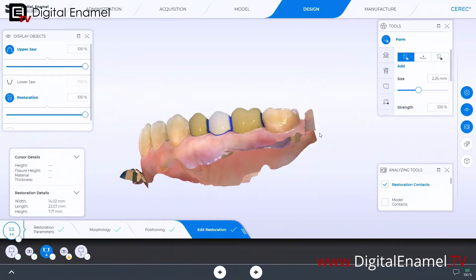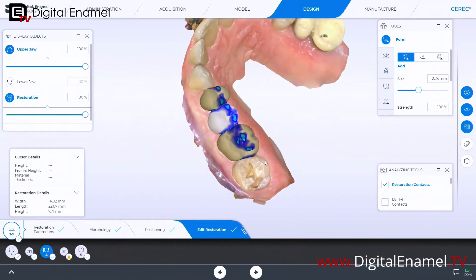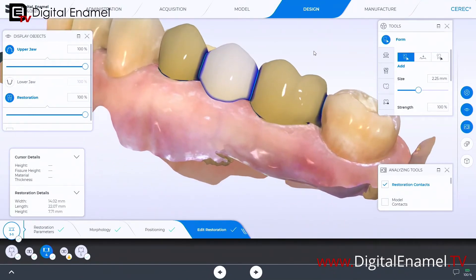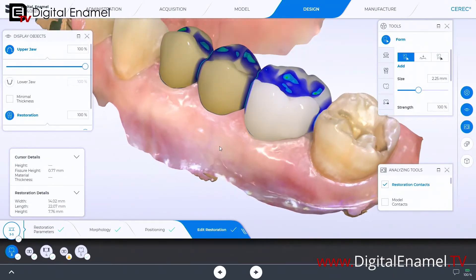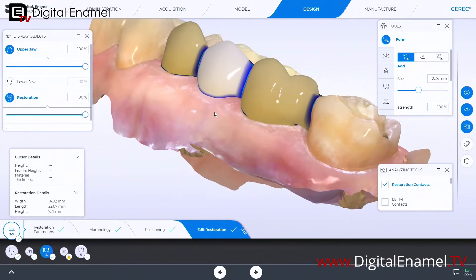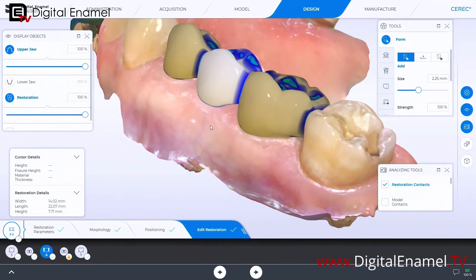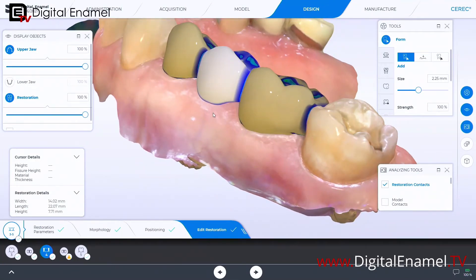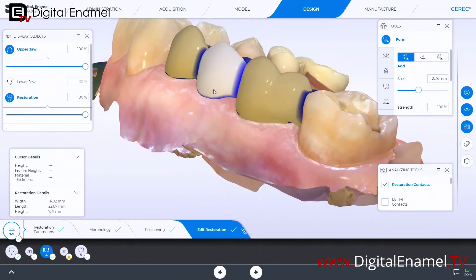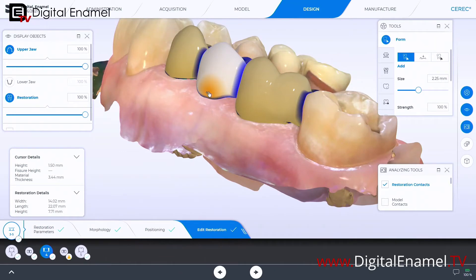I did a 45-minute video on this entire design — check that out on Digital Enamel TV, there's a three-day free trial. But what I'm talking about is this zone here and how we can make it look better. On the initial proposal it's almost always too flat, because in the CEREC software we no longer have to draw what's called the bottom line or baseline, which is a good thing, but it leaves it in a flat type area.